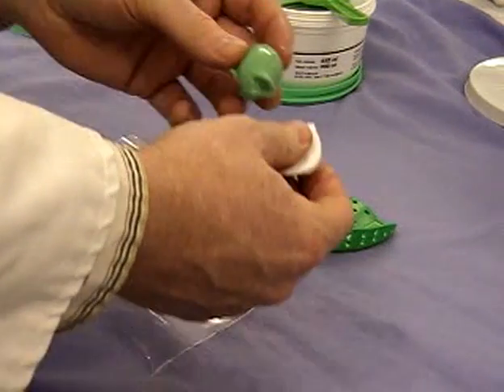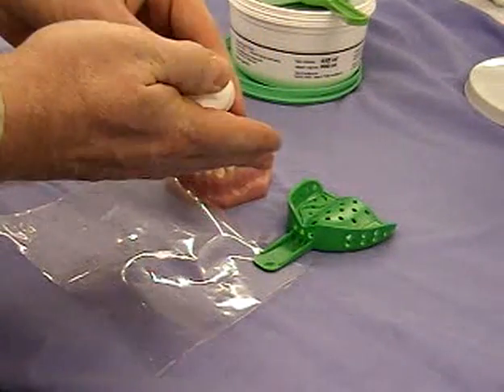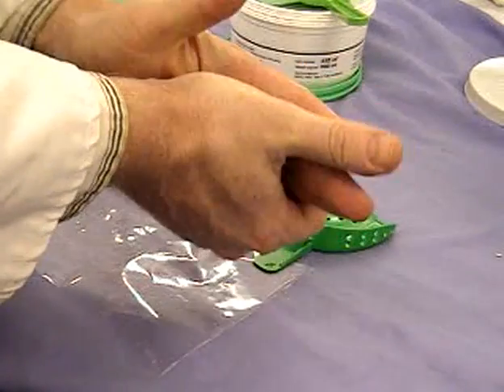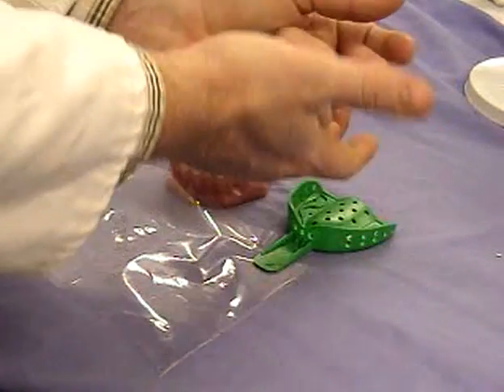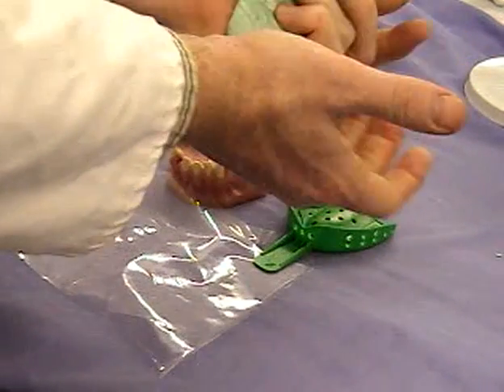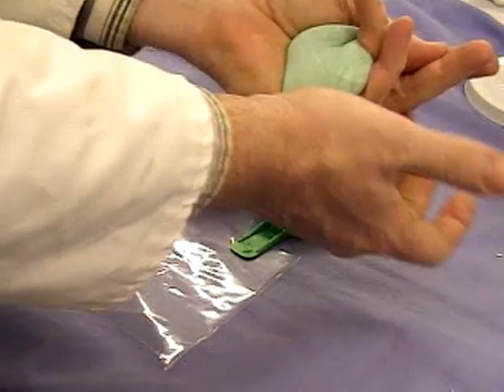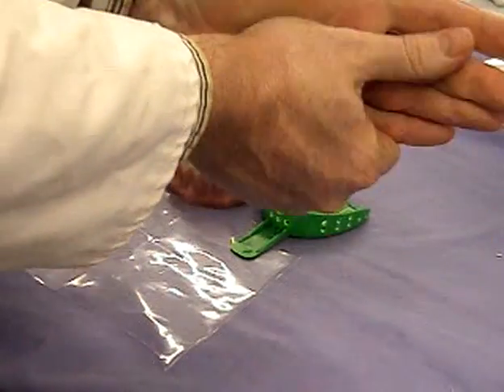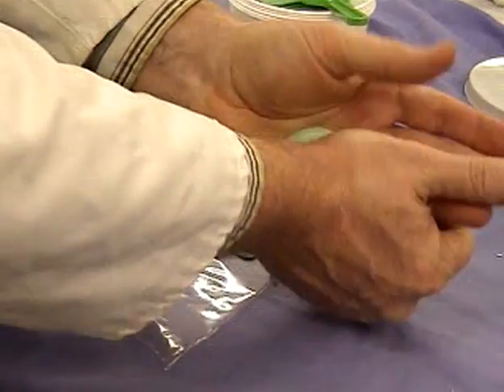The two-stage impression technique is used with a spacer in this case because we're using a belt and braces approach to make sure that we don't damage any of the teeth on your model. The two-stage with spacer technique uses more light-bodied silicone, so we're more likely to be kind to the teeth and leave them in place. It also has the advantage that when you're taking the impression off your cast, once you've poured your diastone into this material, you're less likely to break the teeth on the cast as well.